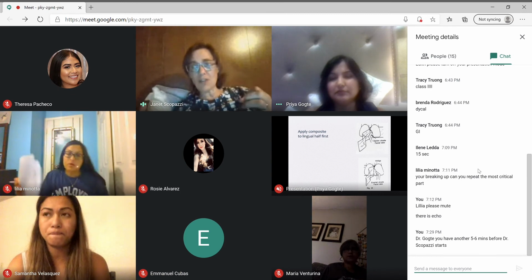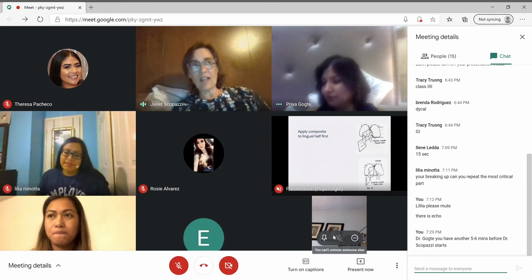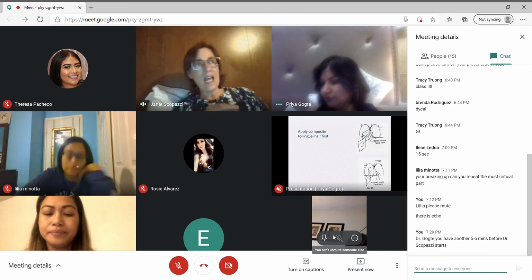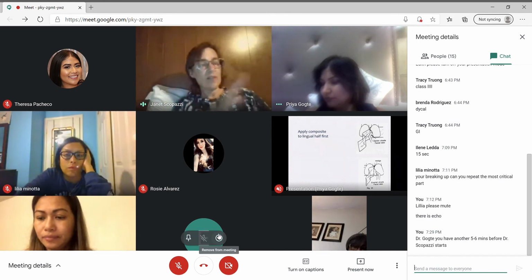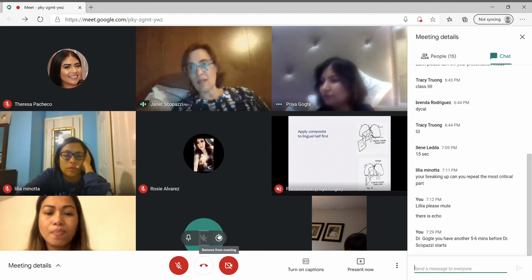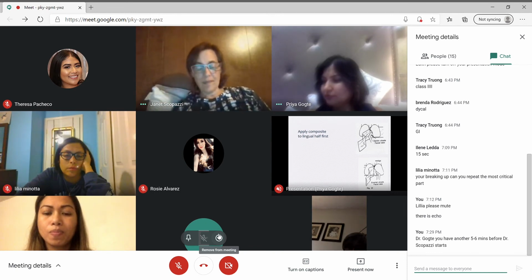Do you have any questions? Like if you're picking an A3 or A2, the A shades, and you put it on there and say, wow, this is too white, you can pop it off and then pick another shade and get as close as possible. That's it.